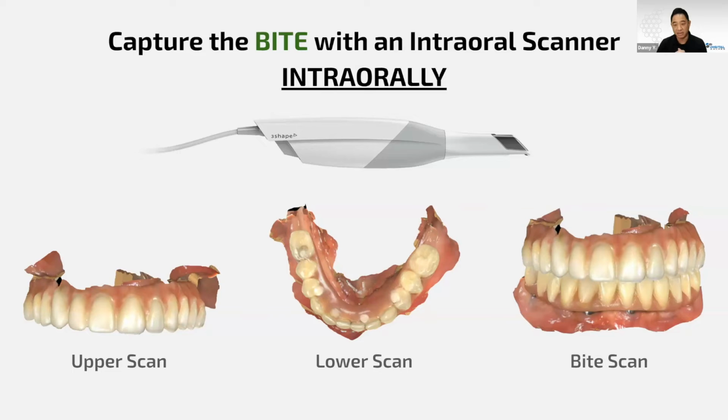An important part of that is that you don't let the patient relax or open their mouth or open their jaw at all between the two scans of the two sides. If they do, they're going to be a little bit different. So it's very, very important to make sure that the patient keeps biting down the entire time when you capture the right and the left side of the bite. If they do open their mouths between those scans, you want to start over again.